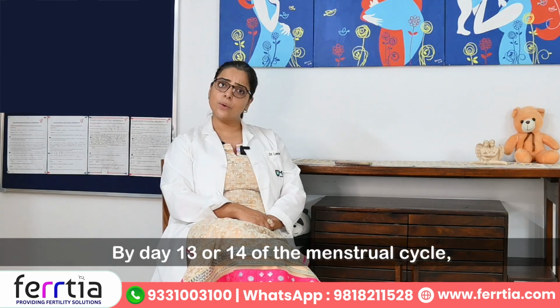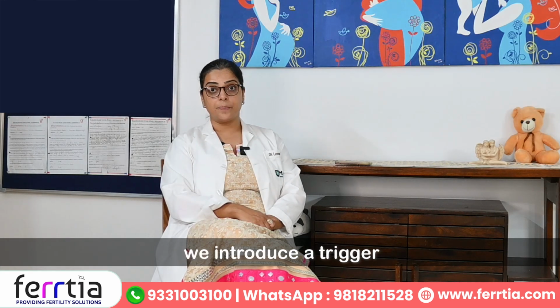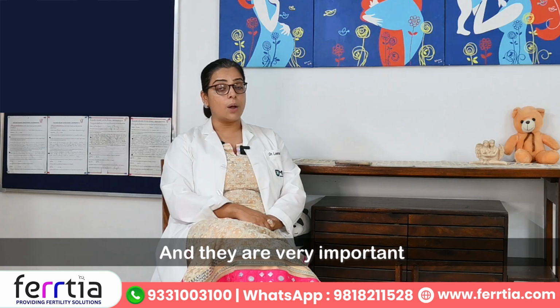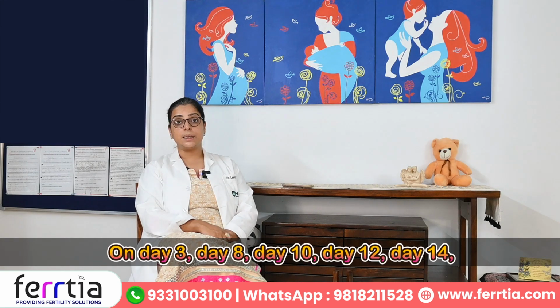By day 13 or 14 of the menstrual cycle, when the follicle is absolutely mature and has a mature oocyte inside it, we introduce a trigger. So these follicle monitoring scans are very important for us and give us a lot of insights, and they are very important on every day of the menstrual cycle which I have mentioned. They have different value on day 3, day 8, day 10, day 12, day 14.